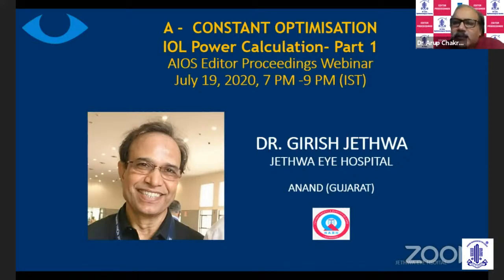In fact, the guest editorial that we had written, Doug, one of the recommendations was that it is time for the industry to start manufacturing lenses with shorter dioptric steps. I think this holds true only for those surgeons who are consistent in getting the postoperative refraction within 0.5 diopters in more than 90%. If you're getting more than 90-95% of patients in that range, perhaps one could think in terms of a 0.25 diopter step. Otherwise, it may not really make that much of a difference in routine surgery.